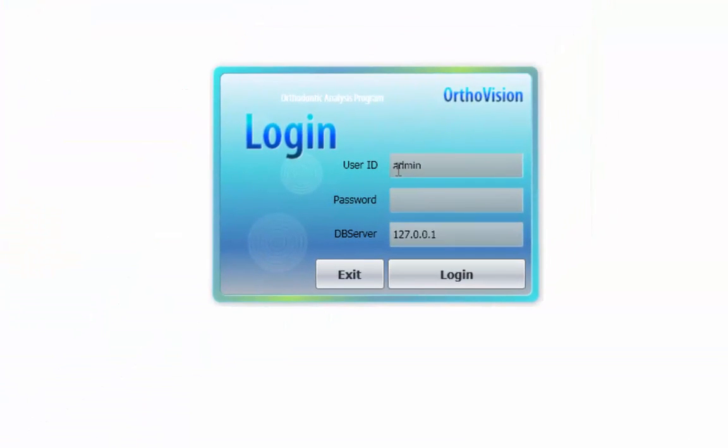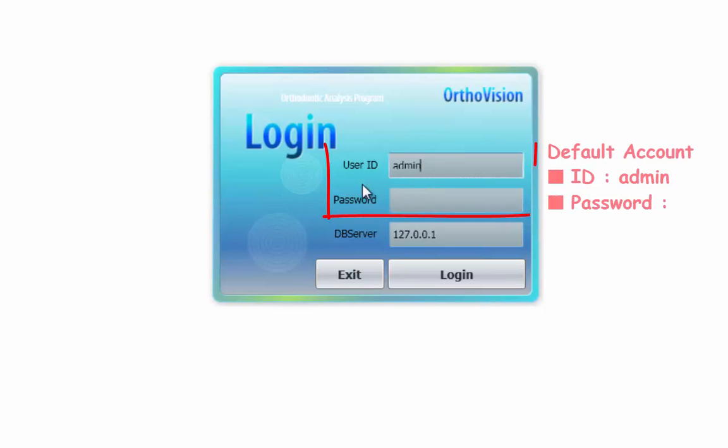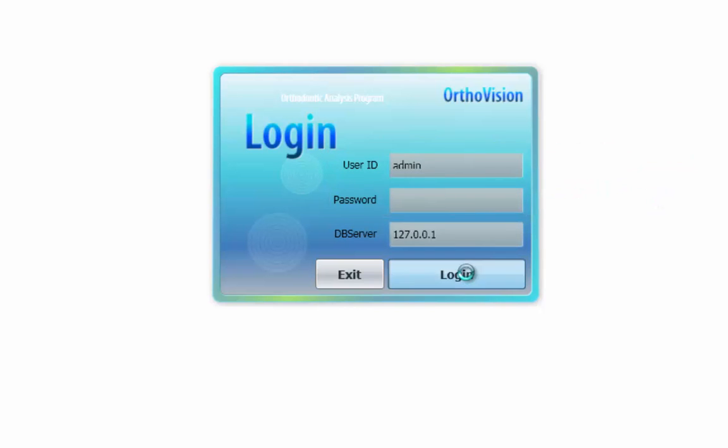Enter your admin password if you have created one. By default, the admin account does not have a password.